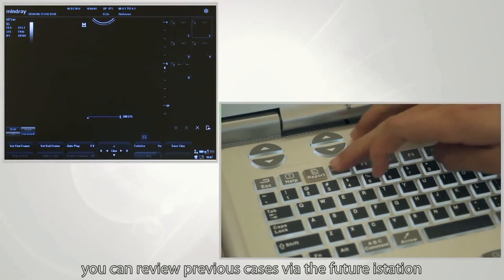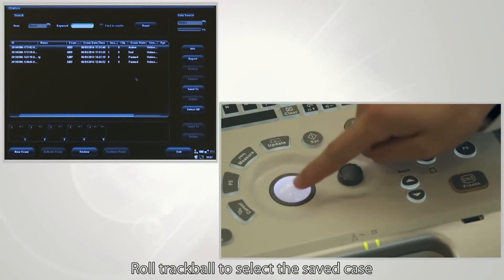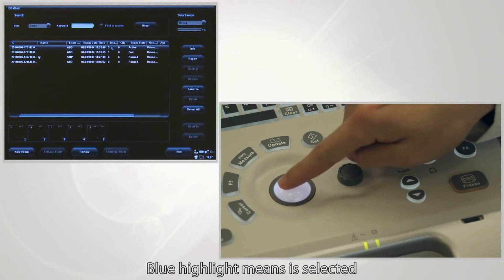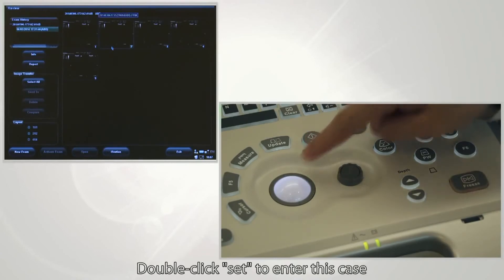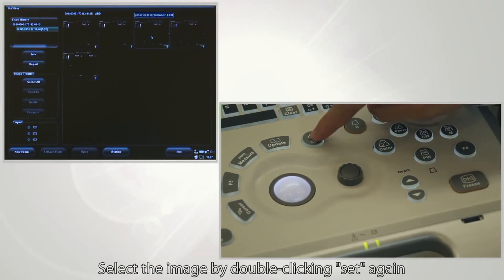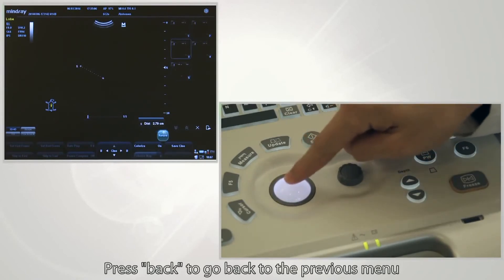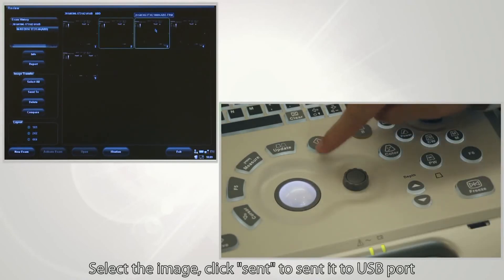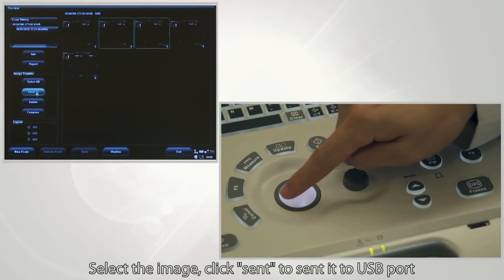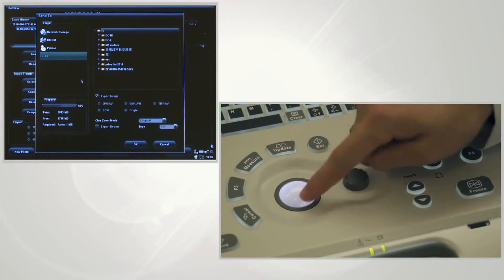You can review previous cases via the iStation feature. Roll the trackball to select a saved case — blue highlight means it is selected. Double-click set to enter the case, then select the image by double-clicking set again. Press back to go to the previous menu. Select the image and click send to send it to the USB port.